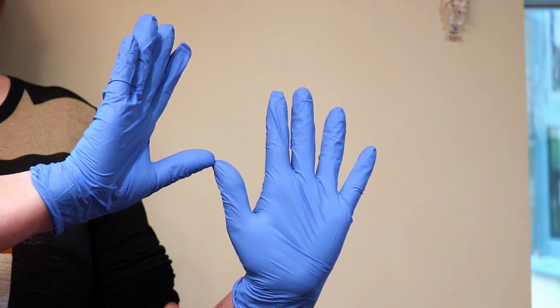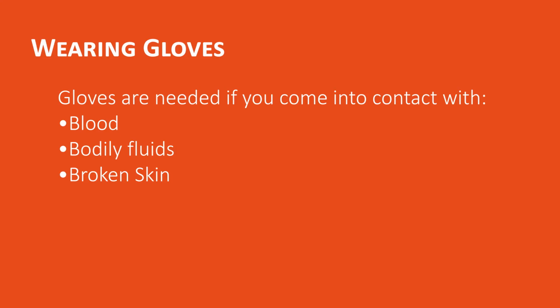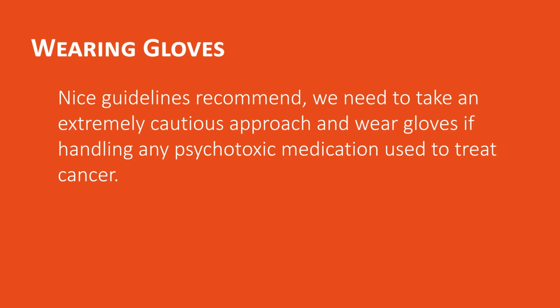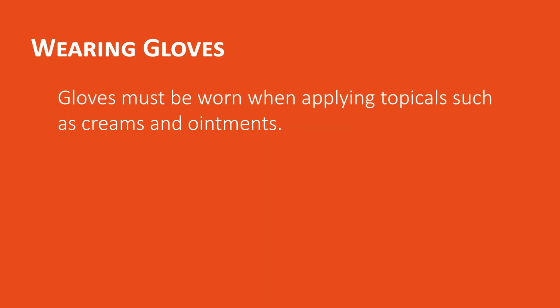Questions are often asked whether gloves need to be used during the administration of medication. Gloves are needed if you come into contact with blood, bodily fluids, or broken skin. Gloves are not needed if you are administering oral medication or for eye or ear care, so long as there are no secretions present. Secretions could indicate that there is an infection. However, NICE guidelines recommend we need to take an extremely cautious approach and wear gloves if handling any cytotoxic medicines used to treat cancer. Gloves must be worn if applying topicals such as creams and ointments.